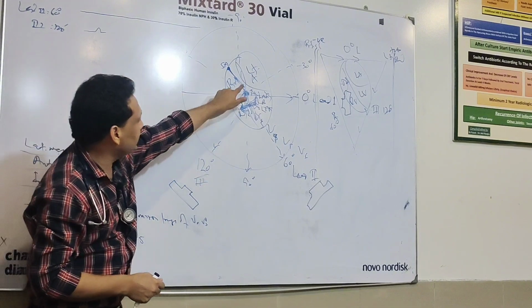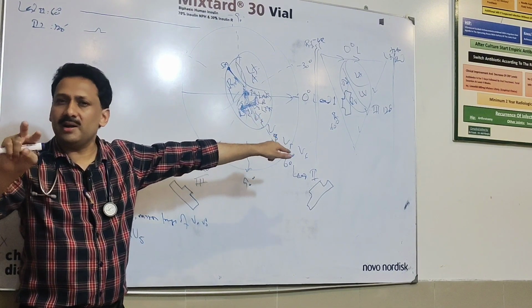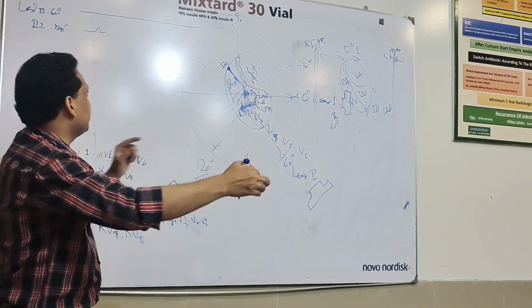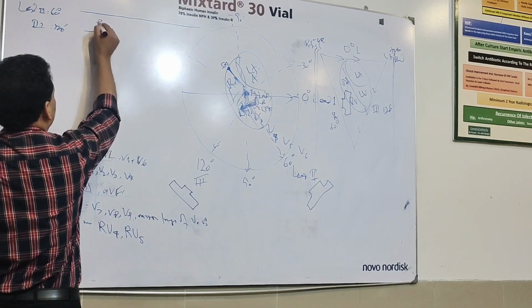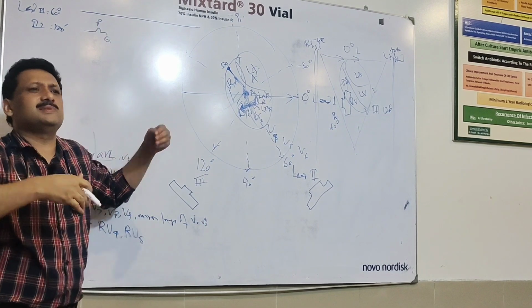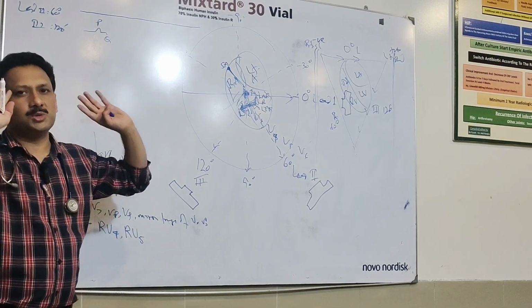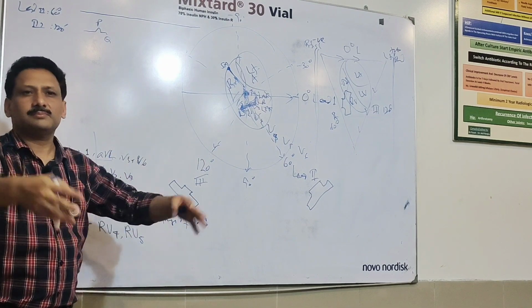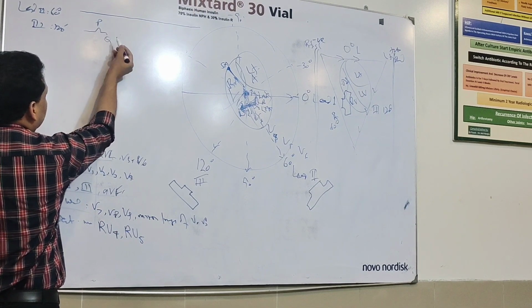Then what happens next? This current goes into the septum. After atrial depolarization there will be septal depolarization, and there is a small wave formation known as the Q wave. So one is the P wave, and one is the Q wave; these waves were just named randomly. So this is the P wave, and this is septal depolarization, the Q wave.